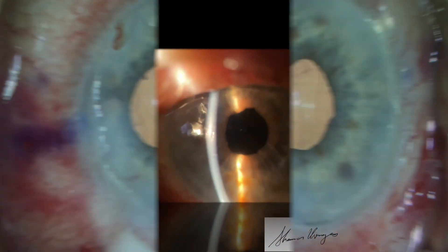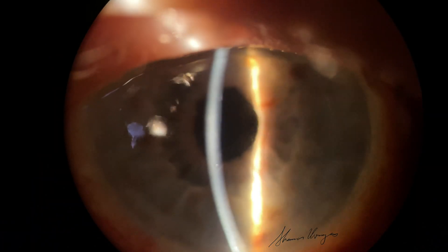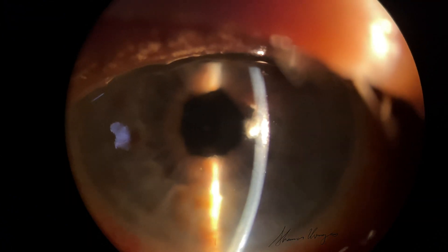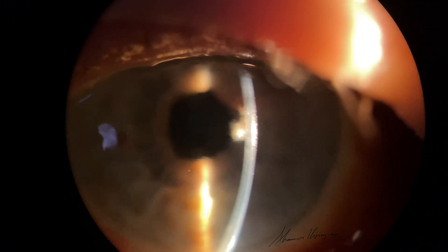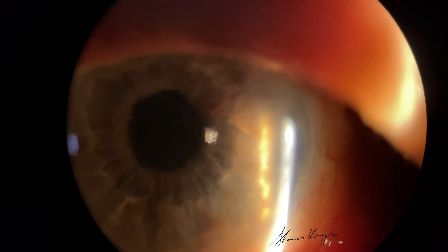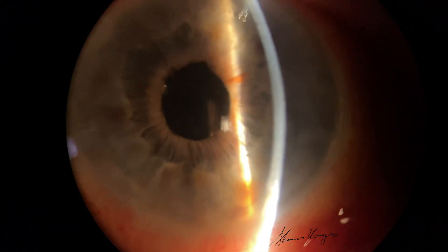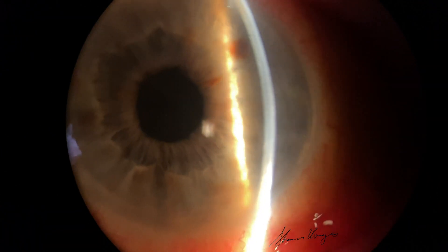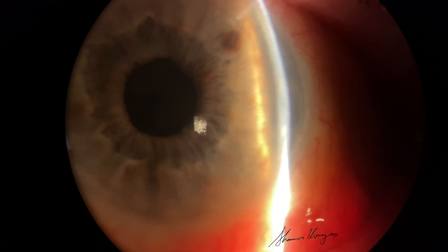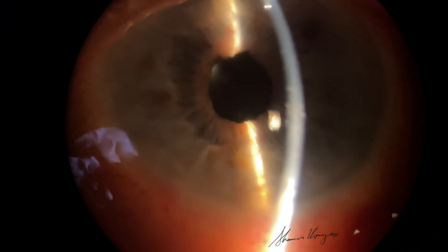One week after intrascleral haptic fixation, this is the slit lamp appearance of the patient's eye. The implant is well-centered. The eye is quiet. The epithelium has grown back and the bandage contact lens is removed. There is mild corneal edema, but overall this patient's eye looks quite good.